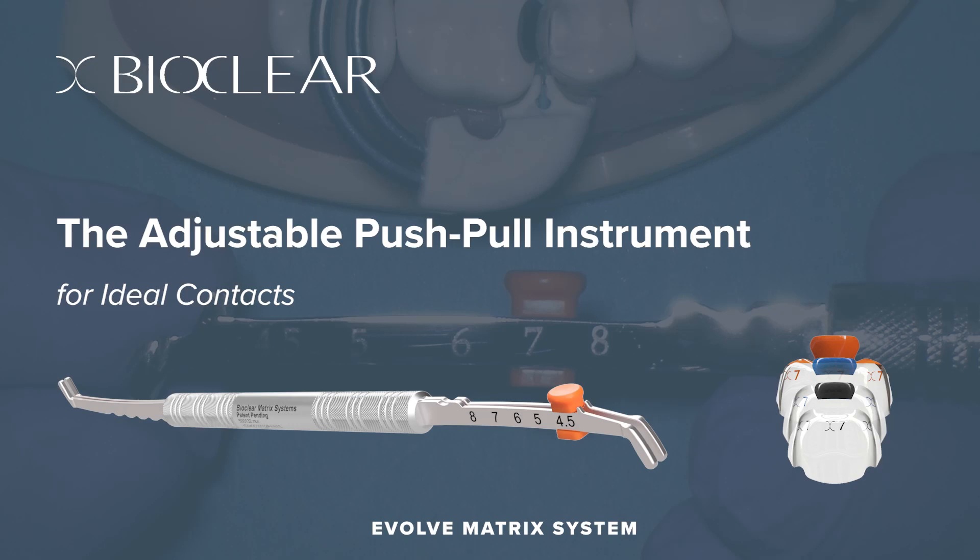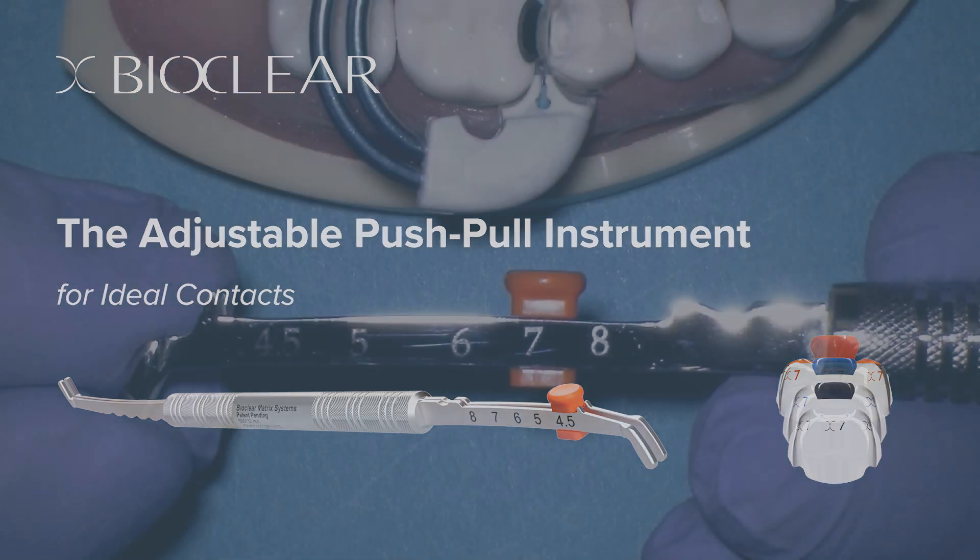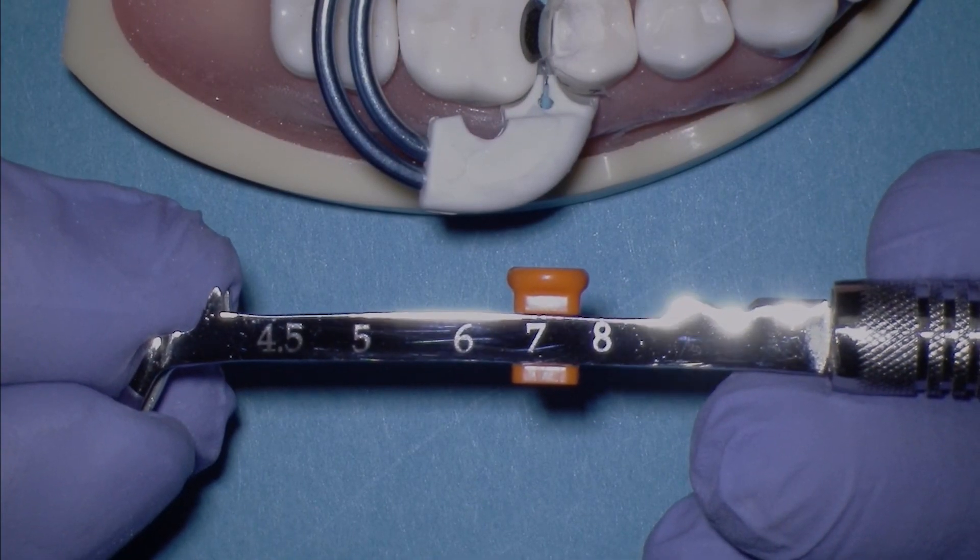Congratulations on your purchase of the new adjustable push-pull instrument by Bioclear. Let me explain how the instrument works.